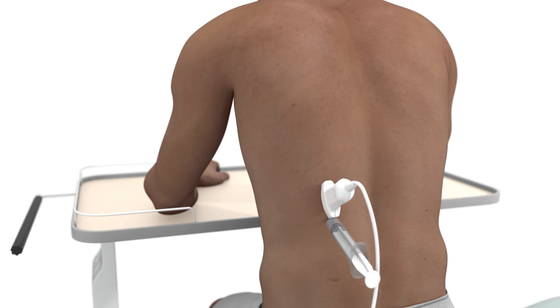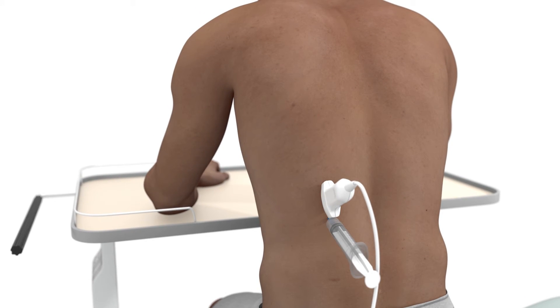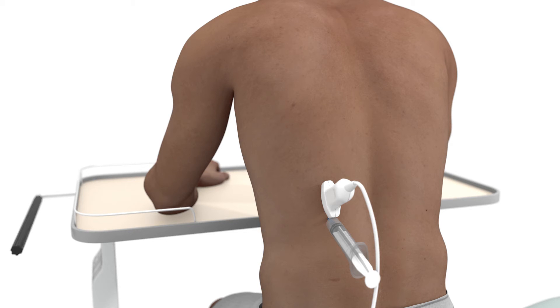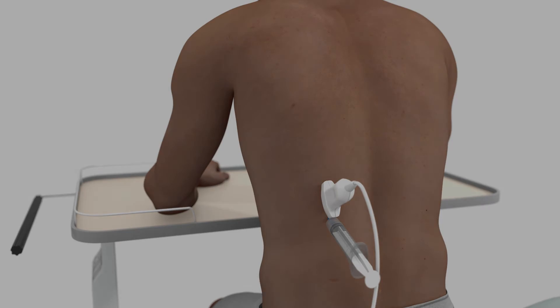However, intubated or mechanically ventilated patients who cannot sit upright can be positioned supine with the head of the bed slightly raised.